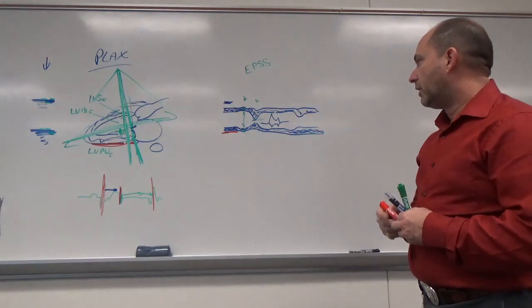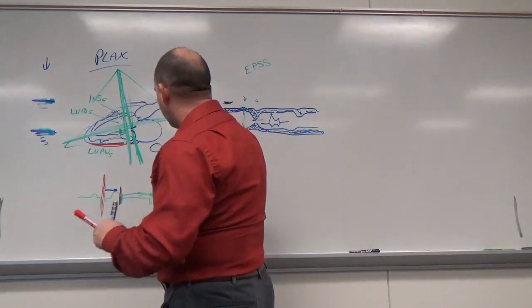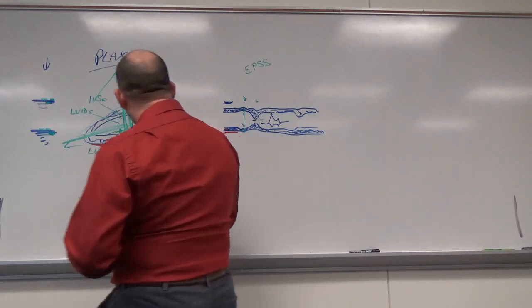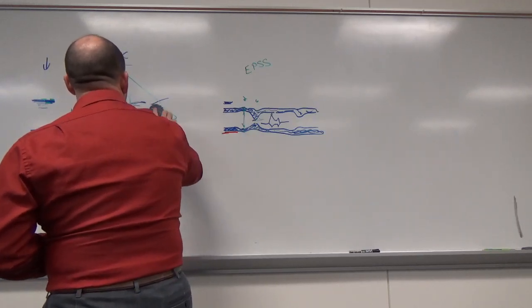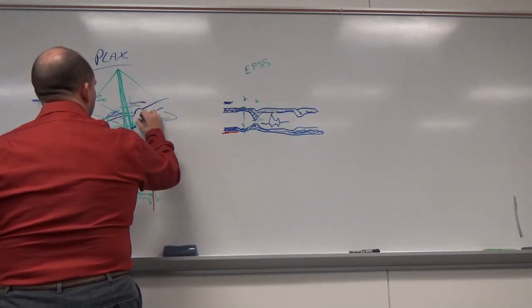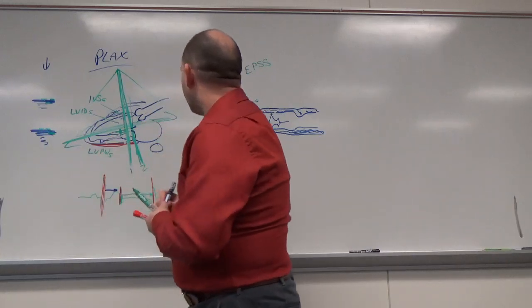Okay, so we've gone there, now we're going to go a little bit further on. There are 3 levels of M mode we take, so this is the first, this is the second. Now the next one I want to go through the aortic valve tips. I'm going to redraw my aortic valve and sinuses of Valsalva so it looks better. I'm going to over accentuate it a little bit here. Okay, so my aortic valve goes through here.